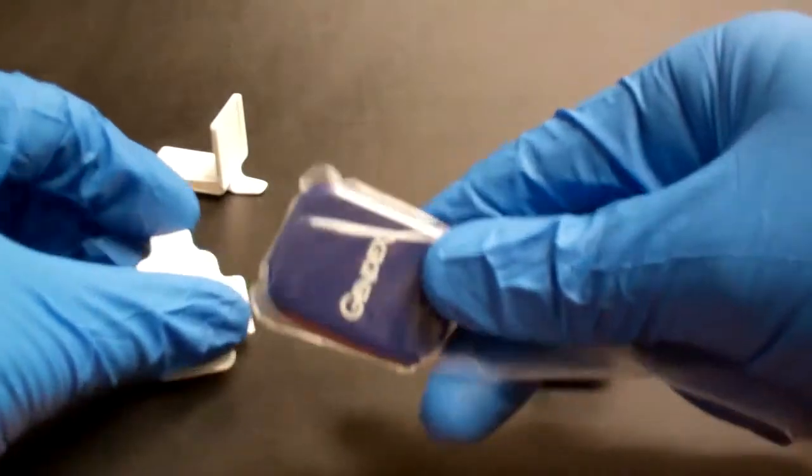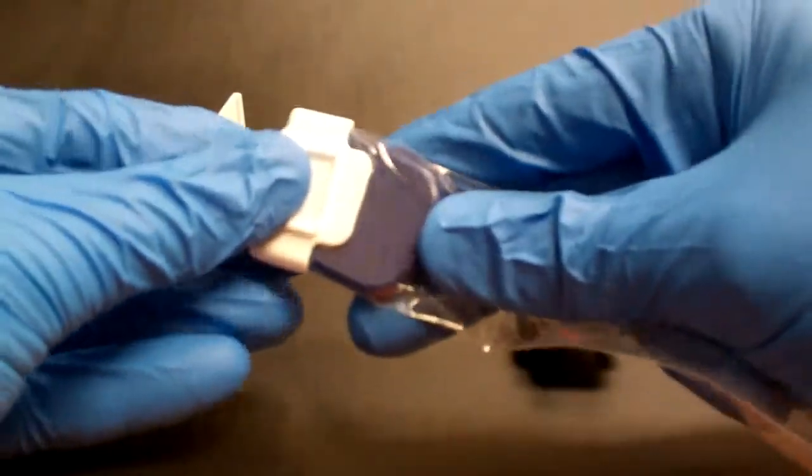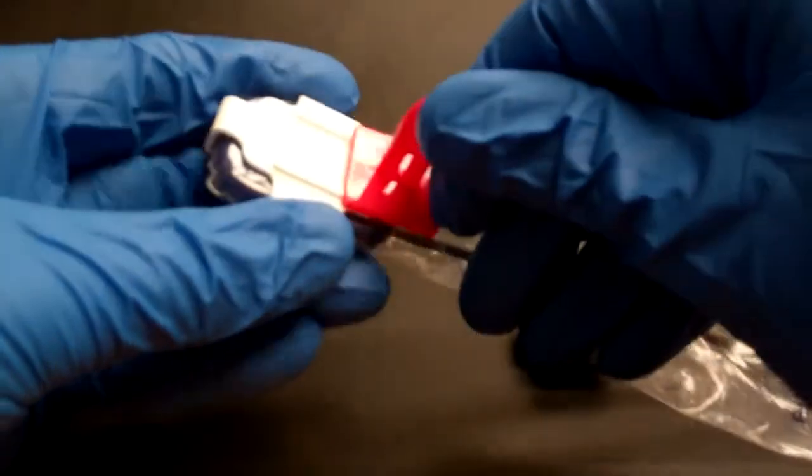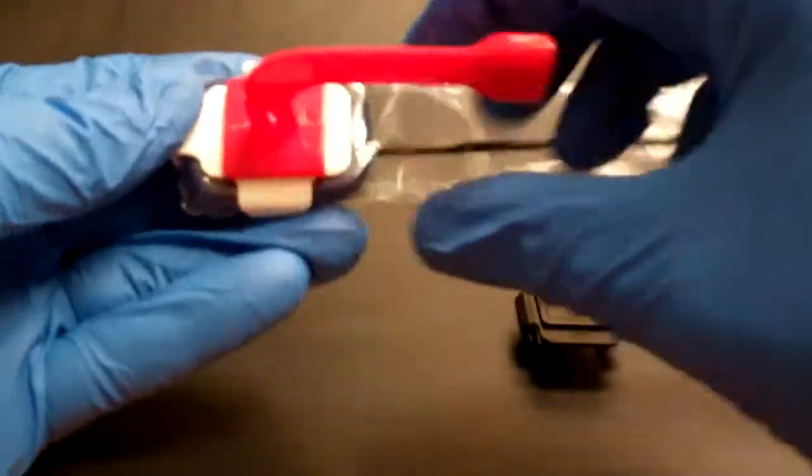So with the size 2 GENDEX GXS770 sensor, you would just slide the white base on. And for a horizontal bitewing, you would just slide on the bite piece like so.